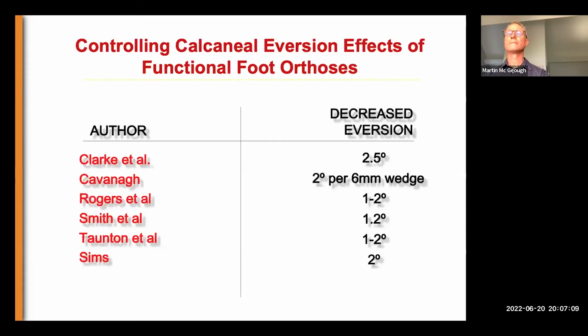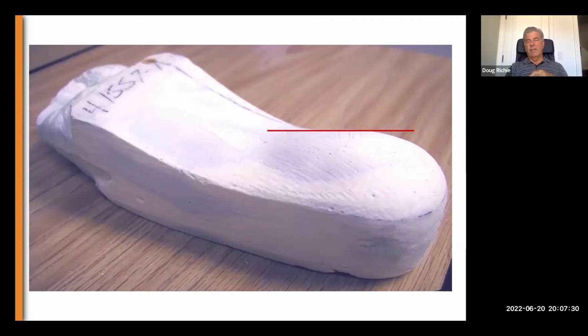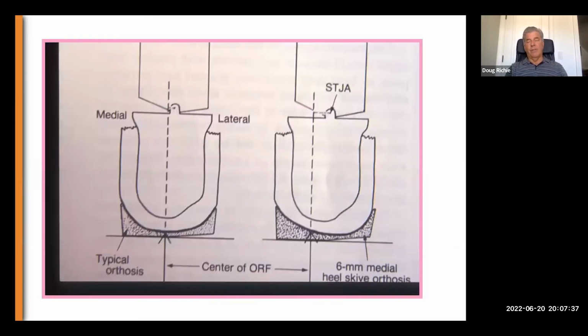And these are just a few studies. Most of you are aware of these, where surprisingly, foot orthoses only improve alignment during walking or running gait on the order of 1 to 2 degrees. They rely on their effect of altering ground reaction forces with the shape of the foot plate itself and the contouring of the foot plate to certain key areas of the plantar surface of the foot. Well, we can still embody that strategy with ankle foot orthoses. We can build a medial skive into a Richie brace and still get some of the positive effects we see with foot orthoses.